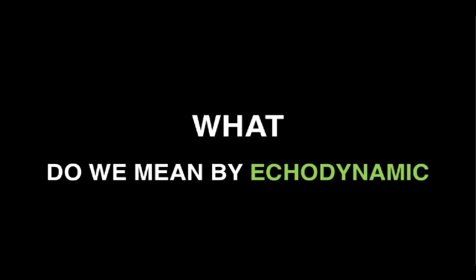But that protocol is really a tool to help us assess and differentiate between the four main categories, try to stratify patients between the main syndromes. But sometimes we need to go a little bit further. We need to dive a little bit deeper. We need to get some actual data. We can use echo, point of care echo, the same tool that you are able to deploy in your daily practice, as a hemodynamic monitor.